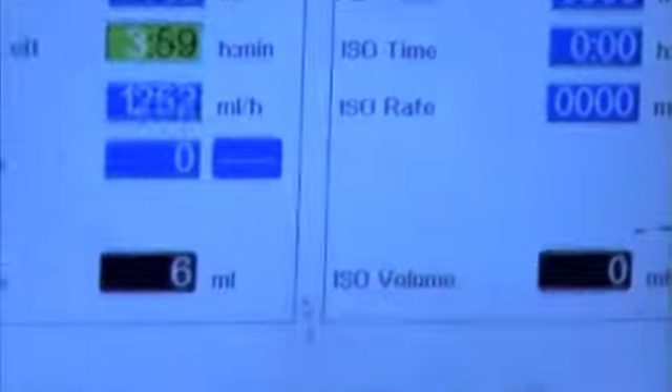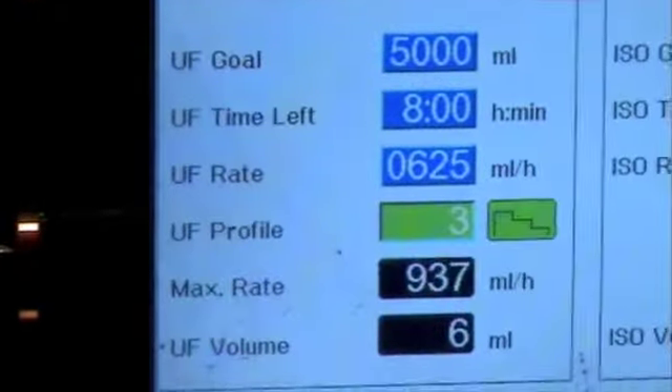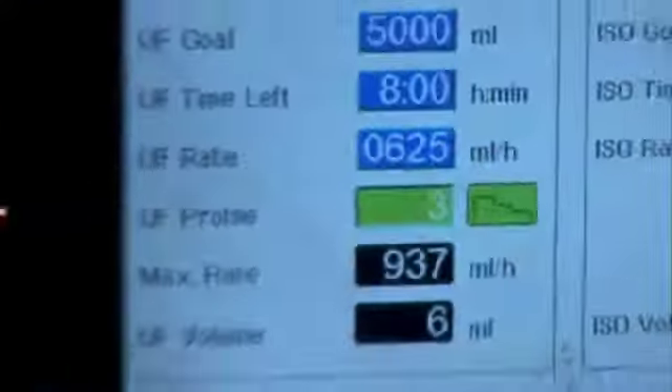I forgot to set the UF limits. I'm going to put about 5 litres and about 8 hours, and I'm going to put a profile of 3, which means that I'm going to have high UF in the beginning and low UF towards the end.